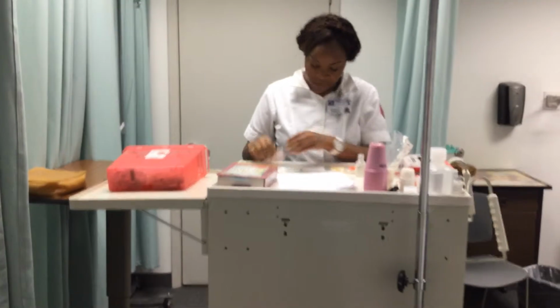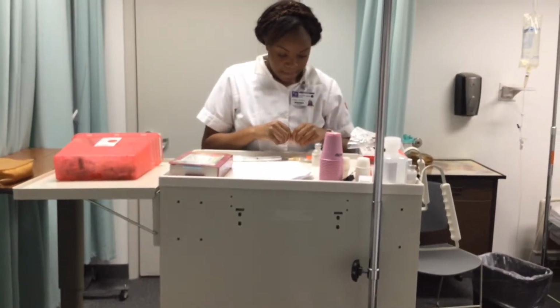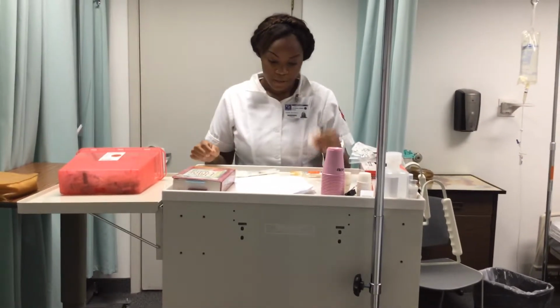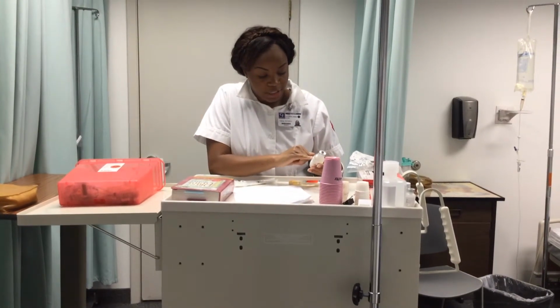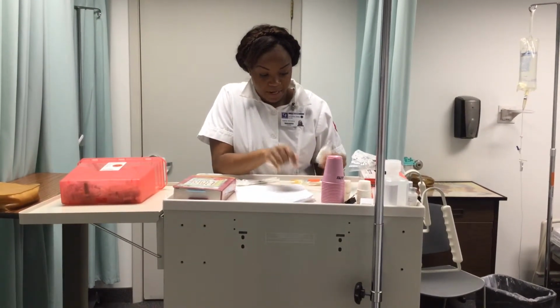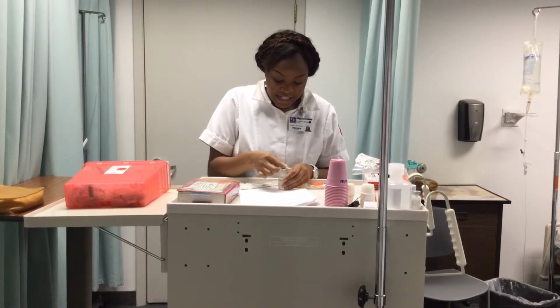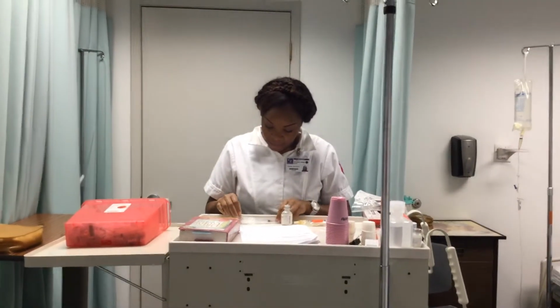So go ahead and get started. Since this is a multi-use vial, I'm going to go ahead and do my first medication check, compare my gentamicin to my med order. Gentamicin 40, gentamicin. So this is my first medication check. This is the right medication. I'm going to go ahead and sanitize this since it's a multi-use vial.